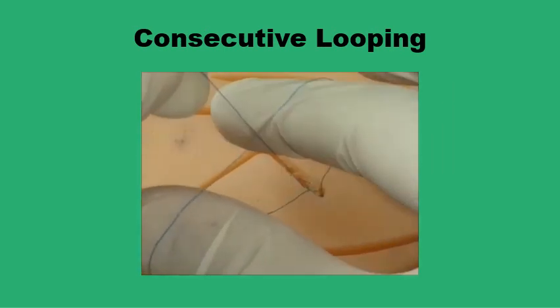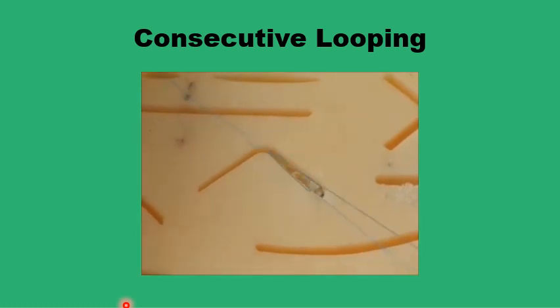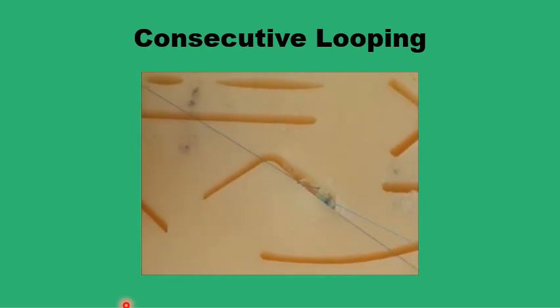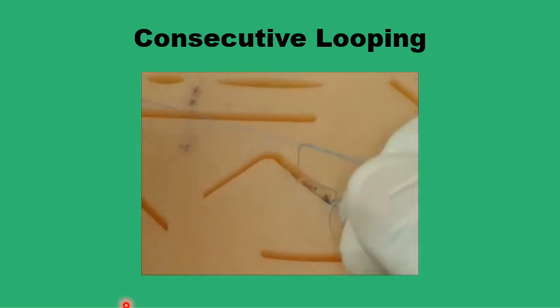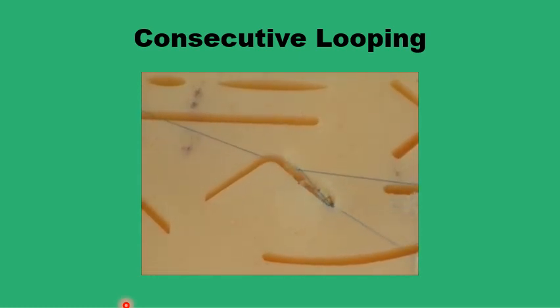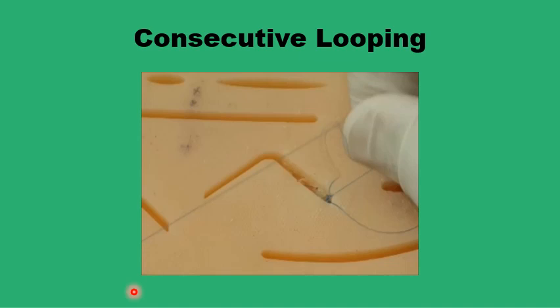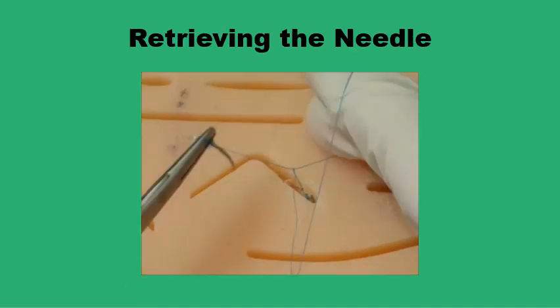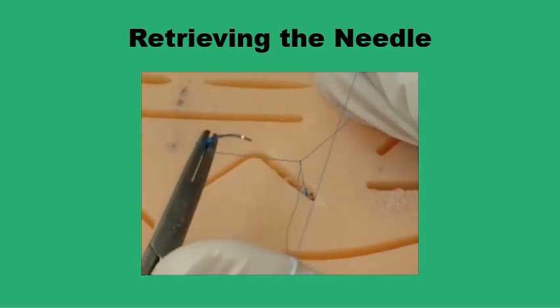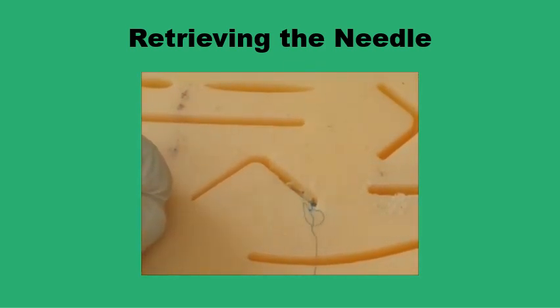You go through the loop, pinch a little bit of the suture, and another loop is formed. Pull so that you start forming the knot, then pull once more to get a new loop and add more to the knot. Continue pinching a little bit of the strand between two fingers and pulling through to add to the knot. Once you are happy with the security of your knot, pull the needle through the final loop and pull on the thread — and here you have a secure knot tied in the depth of the tissues and the subcutaneous area.